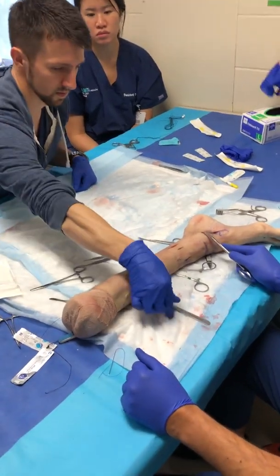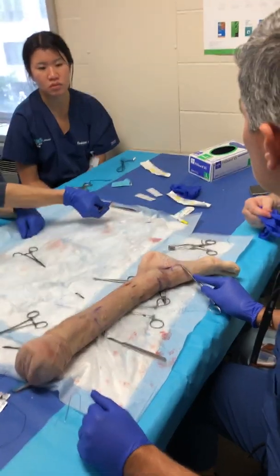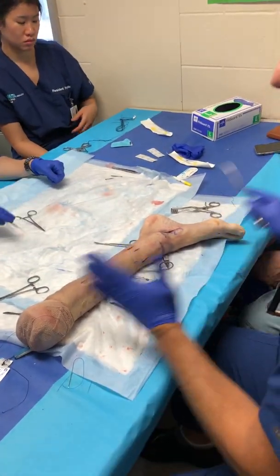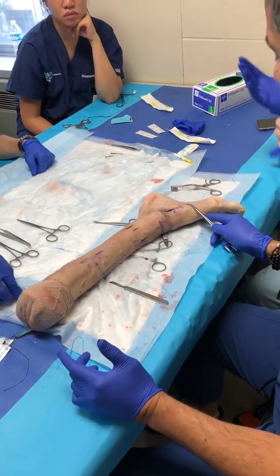Medial border, inferior medial border of the medial malleolus to the inferior border of the navicular. Whatever is the distance depending on the foot size. A big foot, or maybe this big. Whatever, you're gonna open that area, okay?